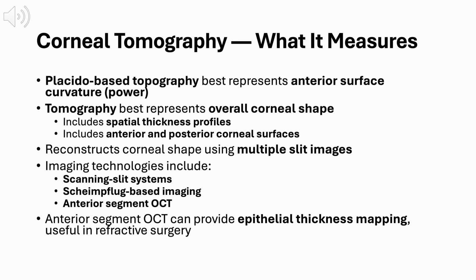Anterior segment OCT adds another layer of value by providing epithelial thickness mapping, which is particularly useful in refractive surgery planning and in detecting early or subtle corneal pathology that may be masked on surface-based maps. So conceptually, think of topography as a surface map and tomography as a 3D model. From here on, we're focusing on tomography because it gives us a more complete and clinically robust understanding of corneal structure.